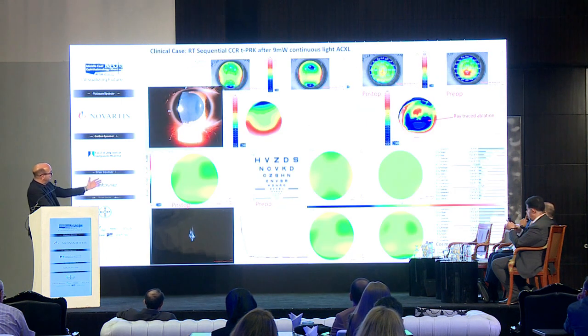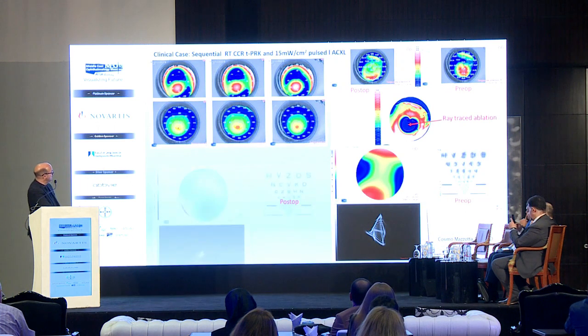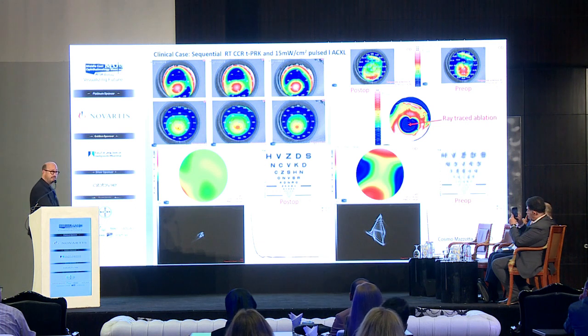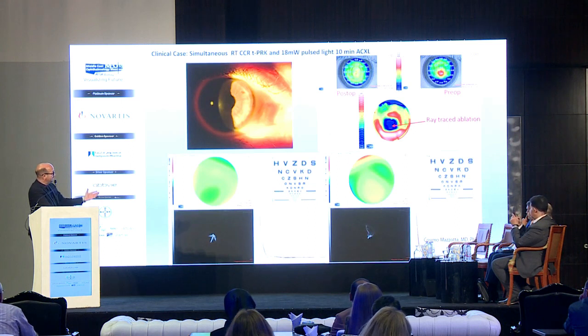These are some clinical cases. You can see the pre and the postoperative point spread function. You can see the ray traced ablation. Again, another case, the pre-op on your right and the post-op on your left. Take a look to the point spread function. It's amazing. Take a look to this.